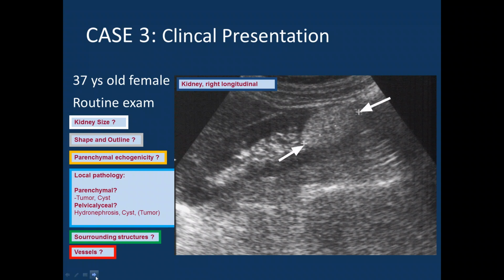a young female, routine exam. The kidney is a parenchymal organ, and the kidney size should be around 10 centimeters in an adult, but this is really the largest diameter you can document. So if you have a kidney with 9.5 centimeters, almost always you can reach 10.2. So the maximum diameter has to be 10 centimeters. But this is quite a good outline for normal kidneys.